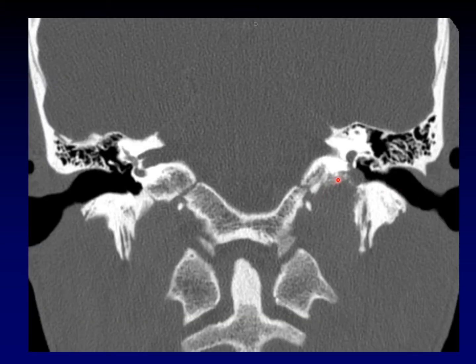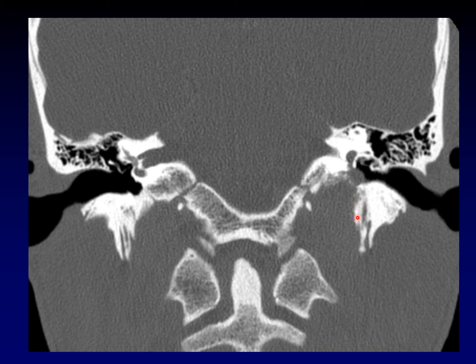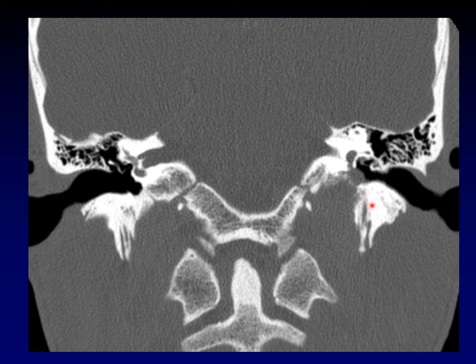Look at this permeative pattern of erosion along the lateral and superior margins of the jugular bulb — that is characteristic of a paraganglioma, specifically a glomus jugulare tumor. Once that glomus jugulare tumor has extended up into the middle ear, we give it the term glomus jugulotympanicum, but it is really a glomus jugulare tumor that found its way to the tympanic cavity. This permeative, erosive pattern with destruction of the cortical surface lining the jugular bulb is indicative of a paraganglioma.